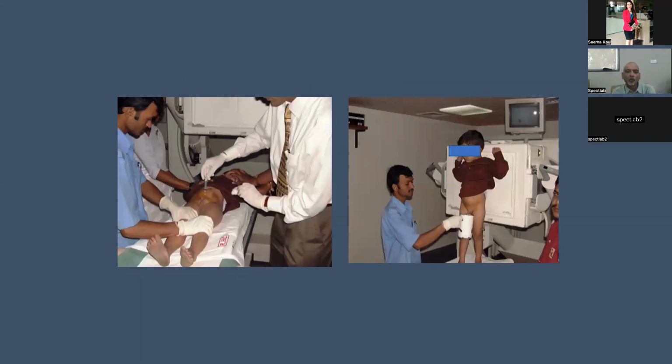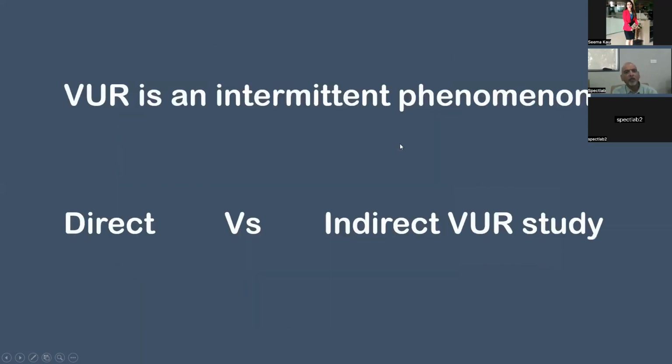And to diagnose vesicoureteric reflux, a very simple, objective, highly sensitive method is the radionuclide voiding cystourethrogram, which is performed without catheterizing the child. You can see here the isotope is being administered in the bladder suprapubically, with a tiny dose of 0.5 ml, and the child is asked to void in front of the camera. You can see bilateral vesicoureteric reflux.